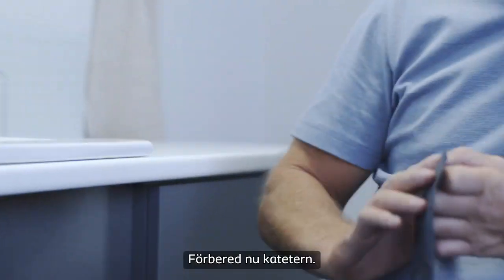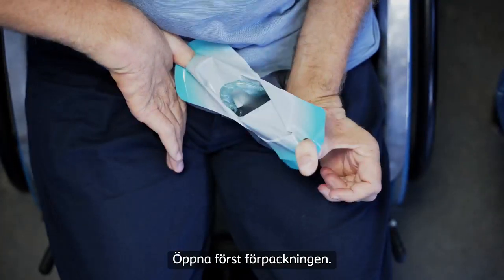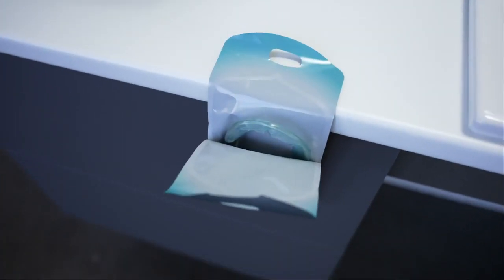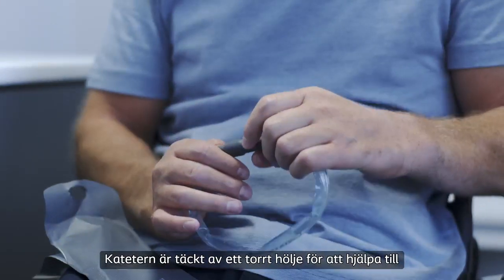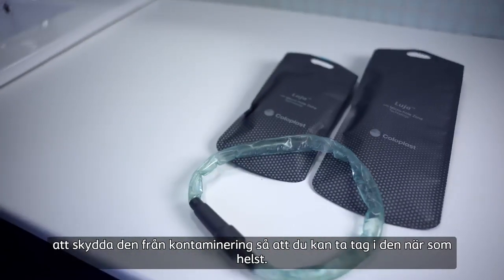Now prepare the catheter. First, peel the packaging open. You can remove the top of the sticker to reveal the adhesive spot and attach this to a clean surface so you can reach it easily. Take the catheter out of the packaging. The catheter is covered by a dry sleeve to help protect it from contamination, so you can take hold of it at any point.